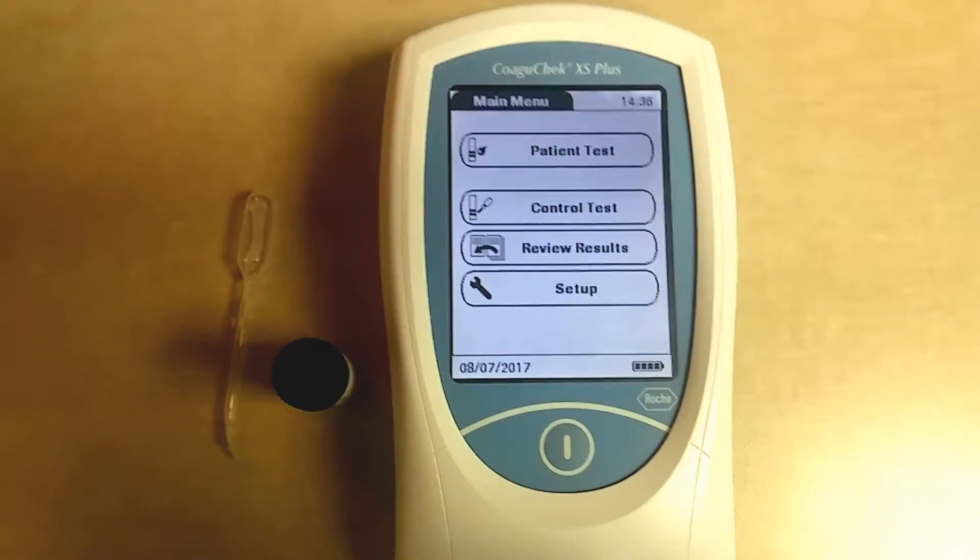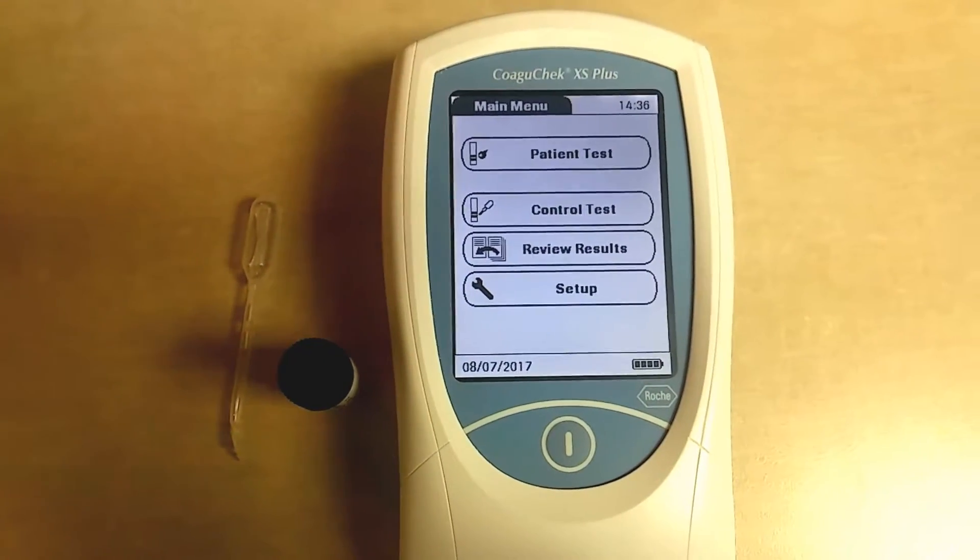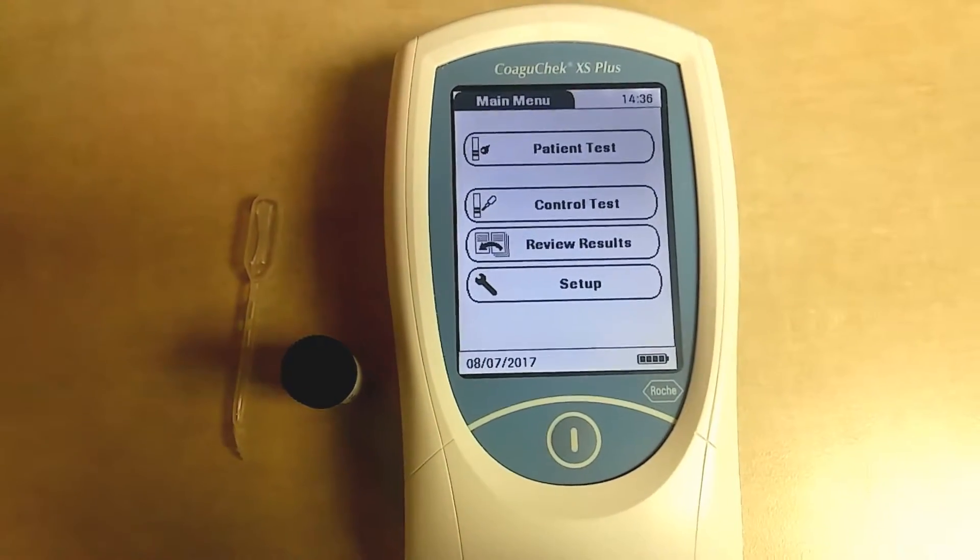Here's what the screen looks like. If you're running a patient, you would click Patient Test, but since we're running the control test, we're going to click on Control Test first.